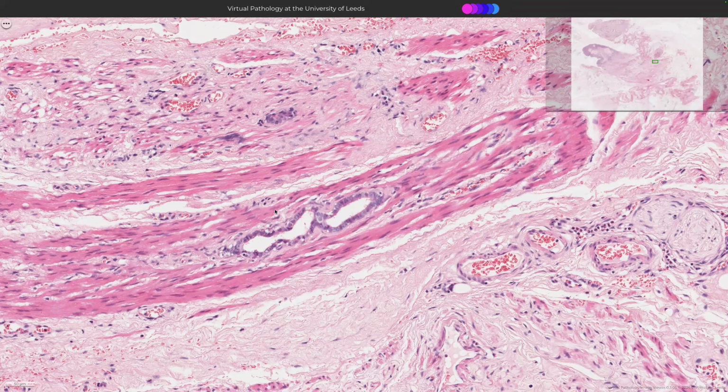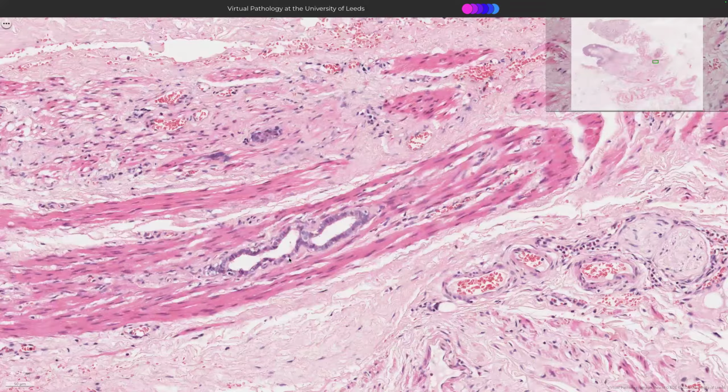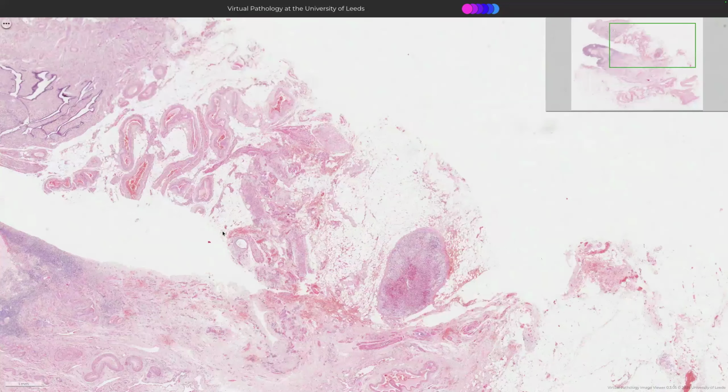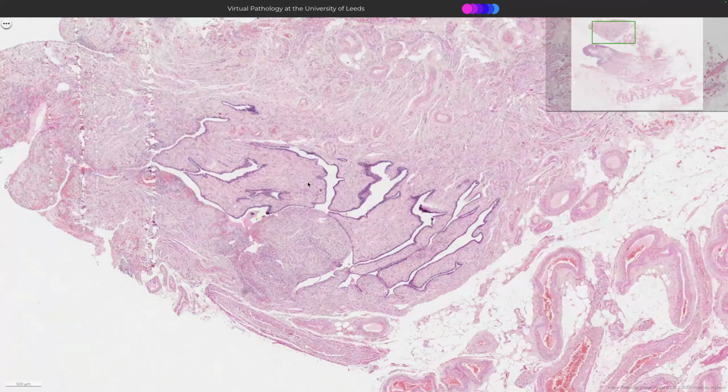It's got smooth muscle around the outside, and they're a bit ciliated. If you go next time you get a vas deferens, have a real good look at it and see if it's ciliated. So these are the mesonephric remnants. Well done. And then over here we have this Mullerian organ, the fallopian tube. So this one is looking a bit tired and worn out because she is postmenopausal. So just like everything else in the postmenopausal female genital tract, the fallopian tubes involute a bit.